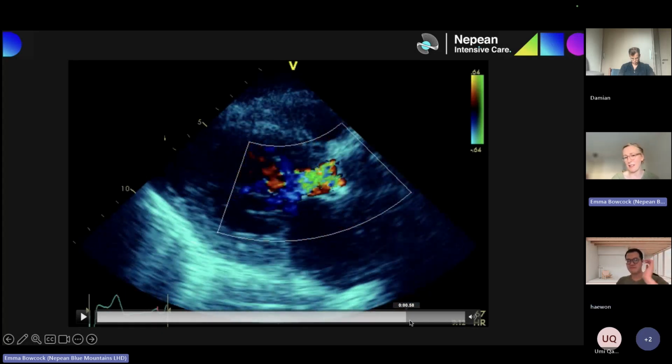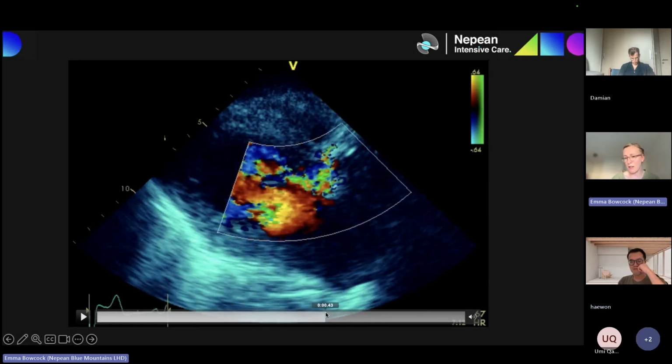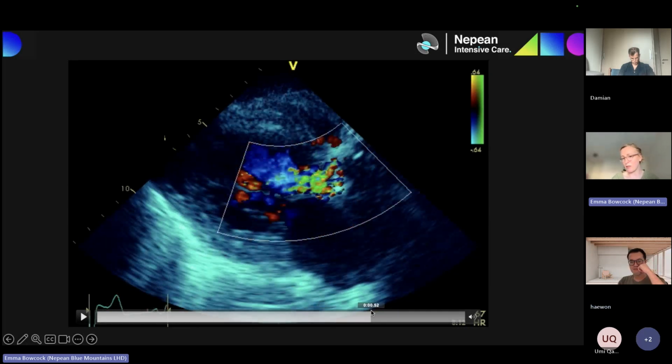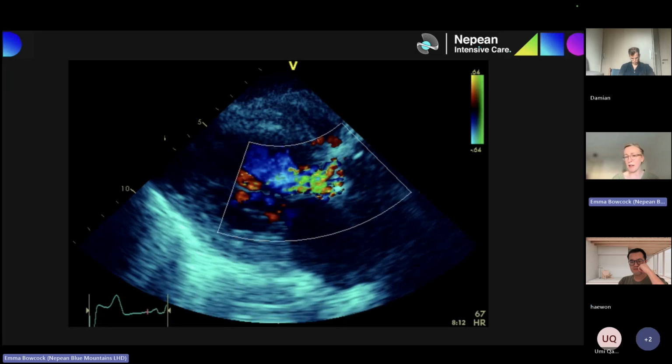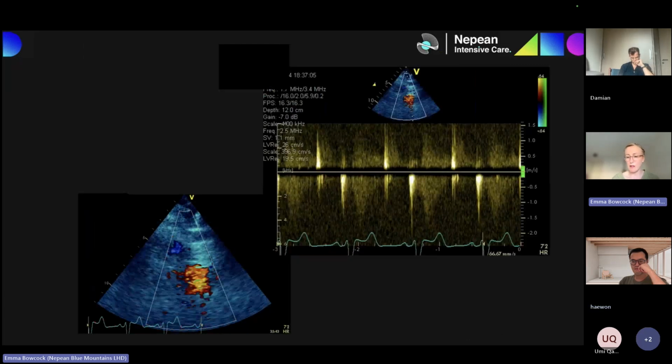Because it looks like it's systolic, because it's not there when you've got no MR when your AR is coming back through there. Anyway, small thing. And then nice about this, really dense, really steep continuous wave through, in keeping with severe. And then you got through to that part.